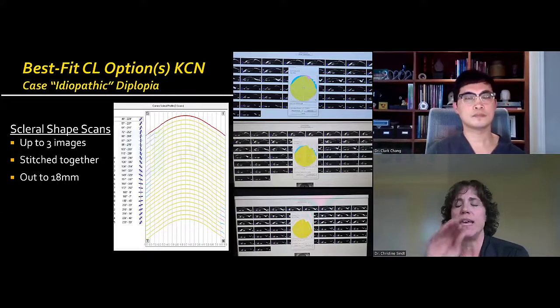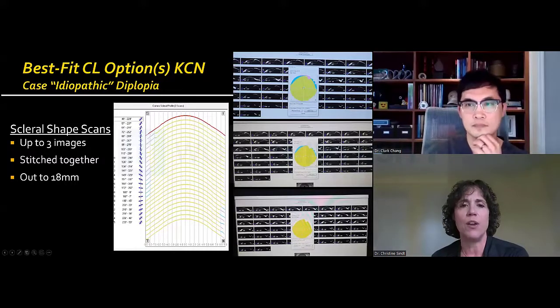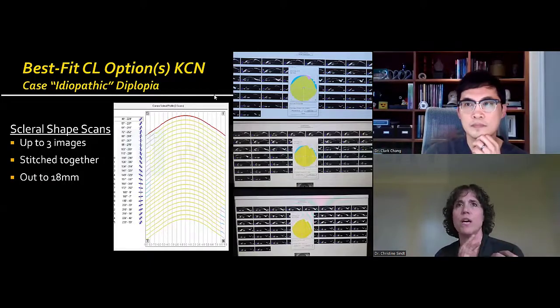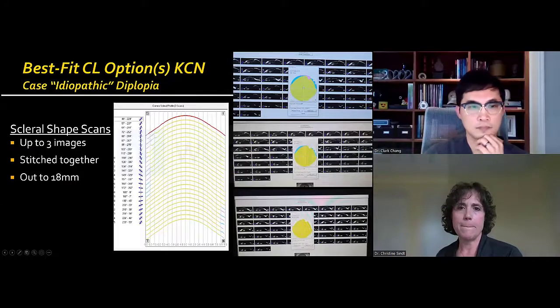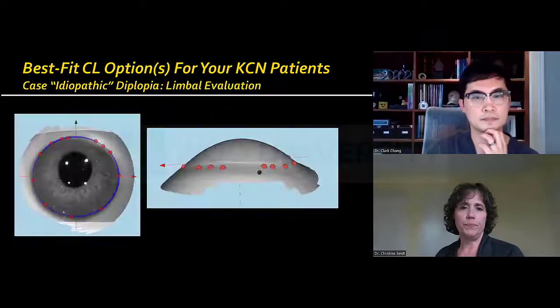What's interesting is that superior area there where there were some elevation differences. You really can see those differences. It's in the pink area here on that upper left-hand corner of the screen there. You can see that's really where he had started having some of those shape changes out onto the sclera. Next slide. Okay, so go ahead, just next one.